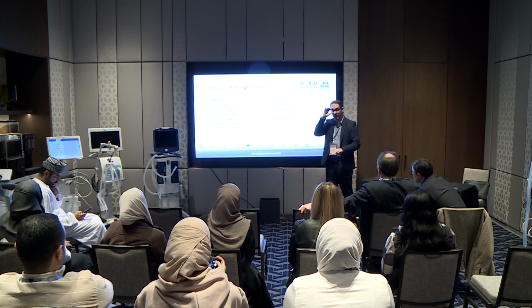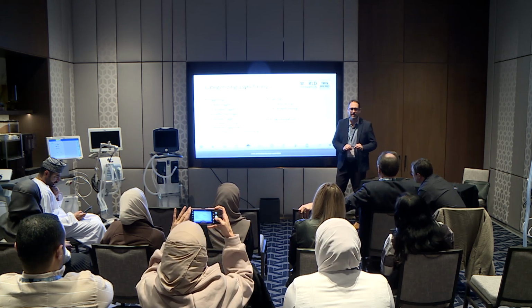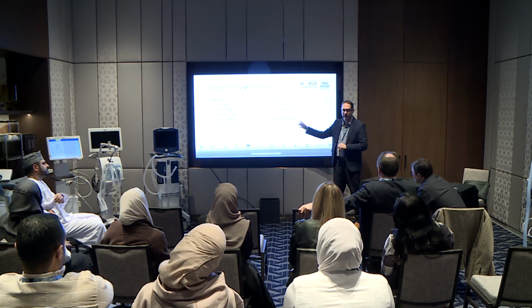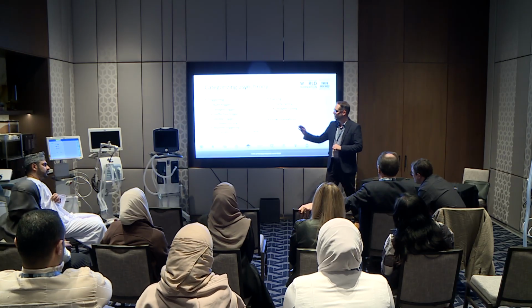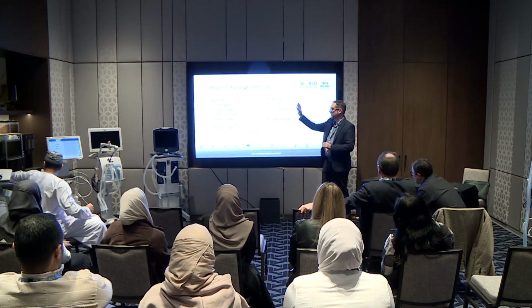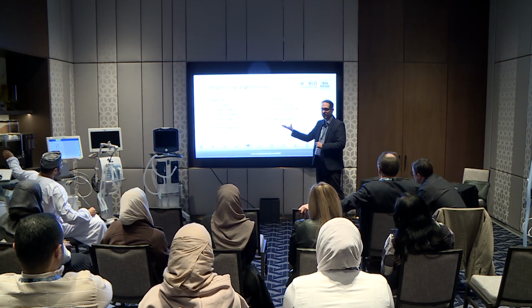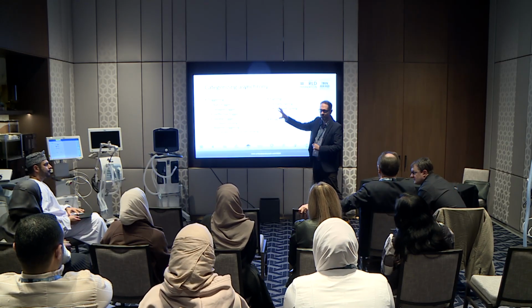Okay, categorizing. Some people will categorize asynchronies as either a triggering problem, a cycling problem, and then flow starvation. A patient could trigger normally, they could cycle normally, but if you don't give the right flow in volume control, they may have flow starvation. So that's why I've separated this out from this group.